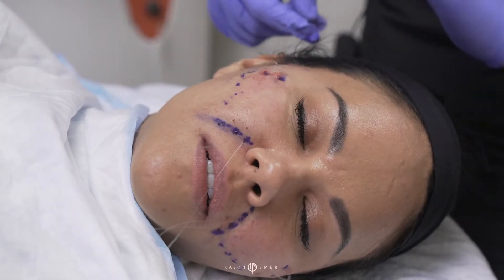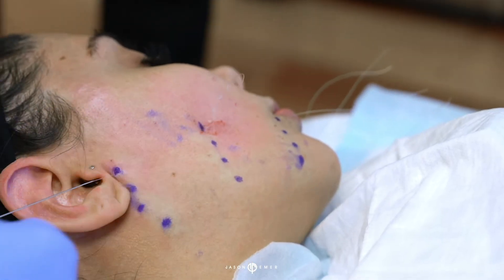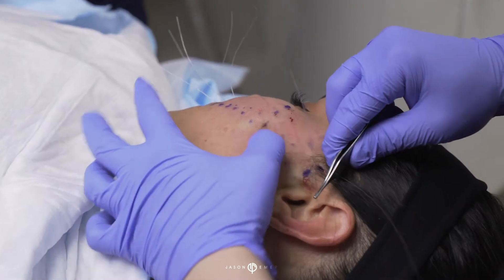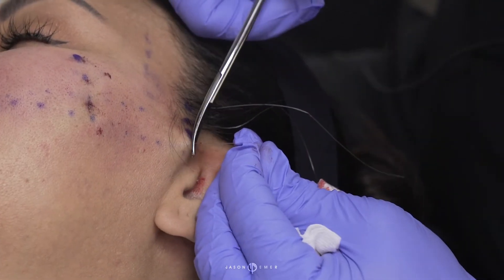Over time, these are made of a specific type of sugar that dissolve into the skin and build collagen. That's our goal — long-term tightening and collagen building. This is a good initial big improvement that she will get and will last her up to two years of building collagen in that area.